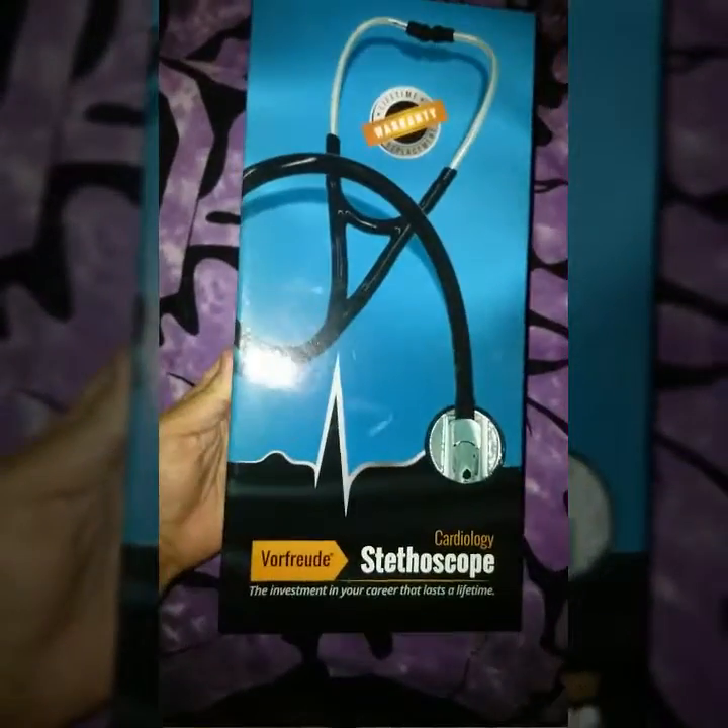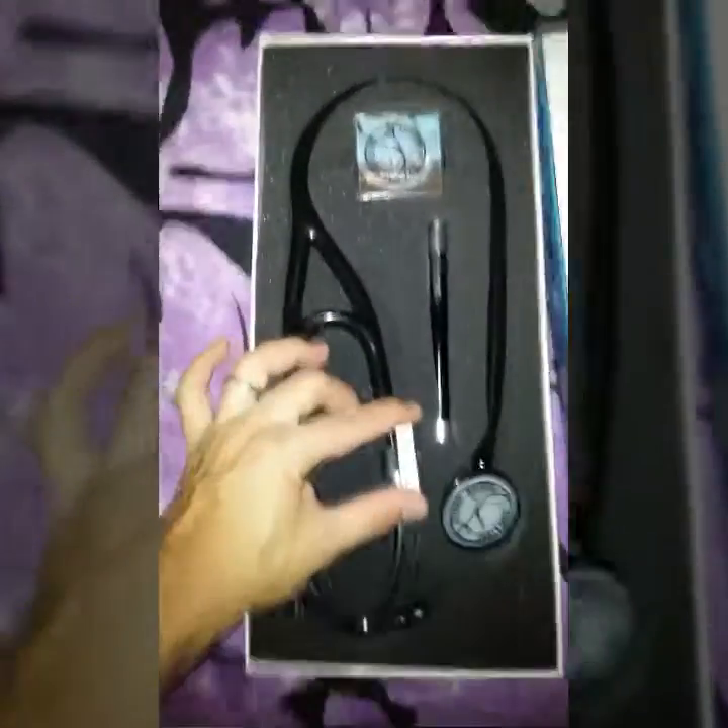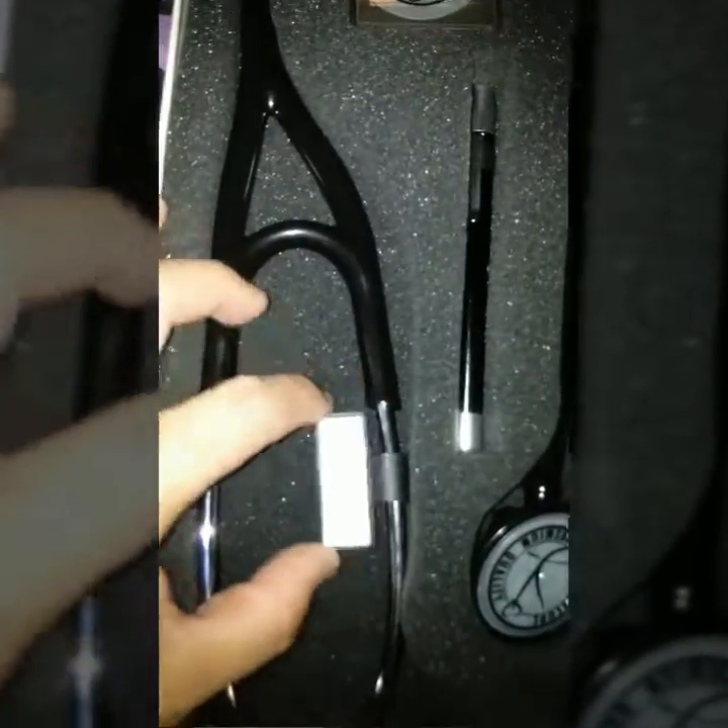This review is for the cardiology stethoscope — a precision handcrafted, patented, binaural flow design. It comes with a name plate.